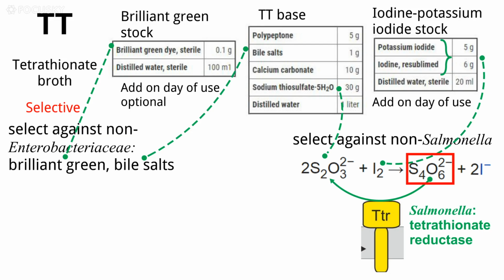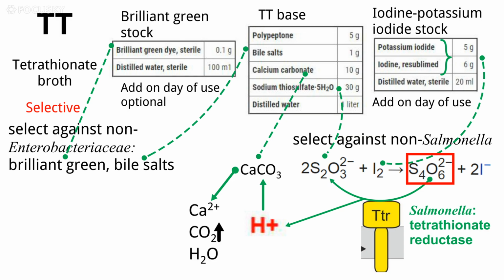However, this redox enzymatic reaction produces a lot of protons. The calcium carbonate neutralizes the protons so that the solution will not become too acidic for Salmonella to live.